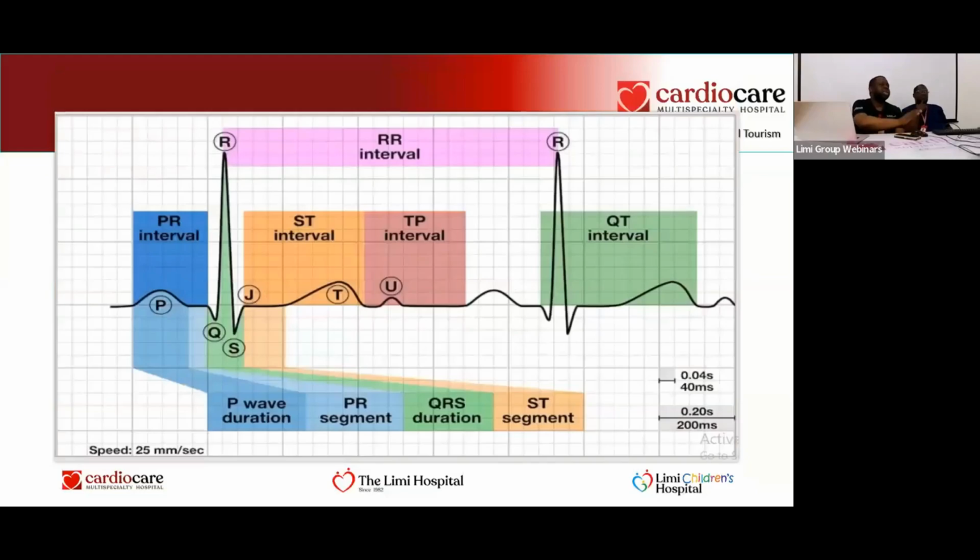So essentially, the ECG is all about intervals and segments. But we are not going to go through all of this, because if you go through all of it, you'll be confused, and you'll not be able to use it for everyday practice. That's why we titled it ECG for everyday practice. So what are the main things you need to know?